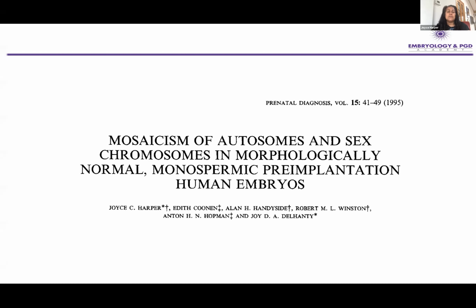Other people who had tried karyotyping in the late 80s, such as Maria Zenzis and Ros Angel, had said that they think human embryos have a lot of mosaicism, but they'd had very low success with karyotyping. So we were really amazed to see the high levels of mosaicism. To be honest, at the beginning, I thought I was doing something drastically wrong with my FISH. I kept saying, my FISH is not working, everything's crazy. But then we trusted our instincts and reported this back in 1995.